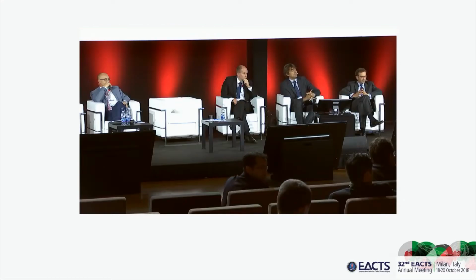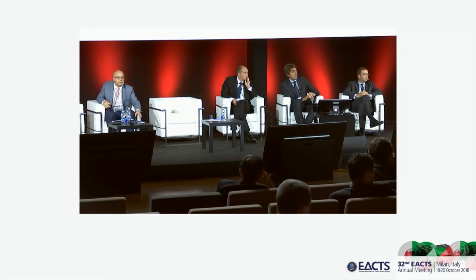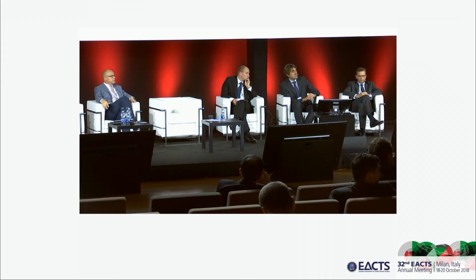Maybe just a confirmation of what you said, because there is one thing that I think cannot be overestimated. This multiplanar reconstruction is essential. Yes, it takes time to work your way into 3D assessment, and these spatial images, these 3D images are nice to look at, but the true importance of 3D, and this is so vital for adequate repair, is multiplanar reconstruction. It takes some time. We as surgeons have to learn to be patient.